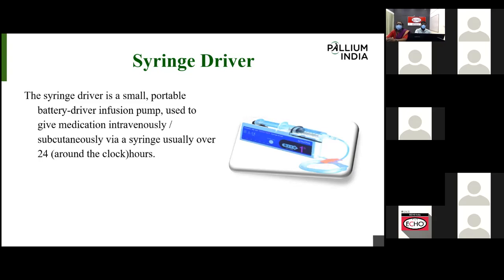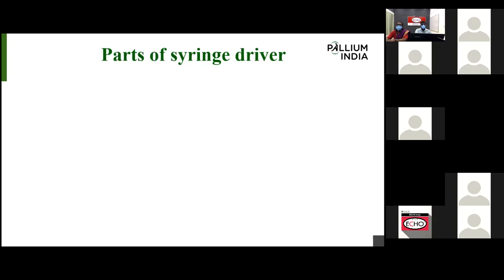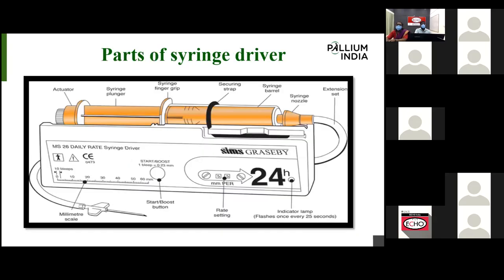This syringe driver has one benefit, mainly I can say: not only in hospital, in a home care setting also we can use this syringe driver. In the case of a syringe pump, we cannot give it in the home setting. This one is the first benefit of the syringe driver. These are all the parts of a syringe driver.